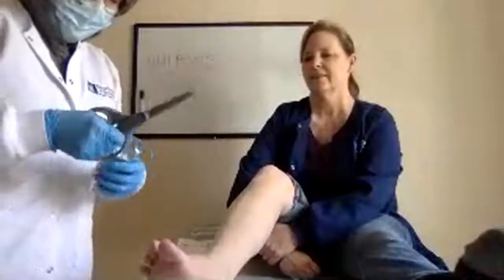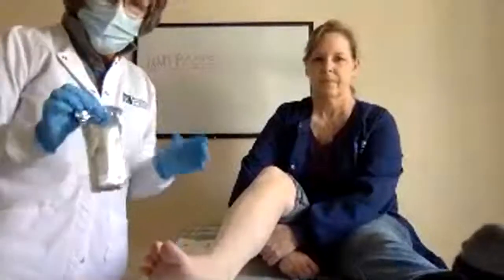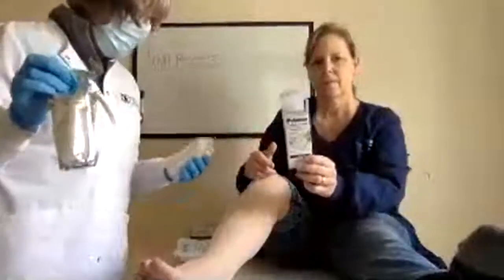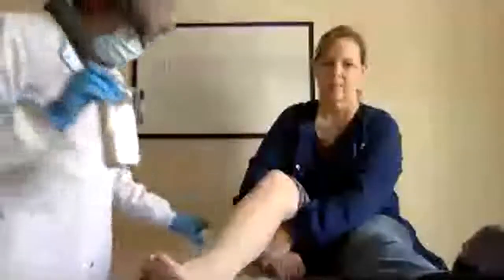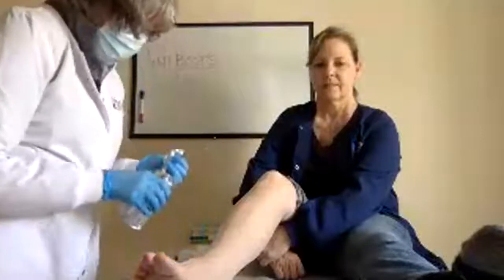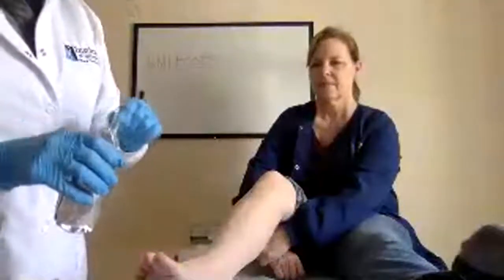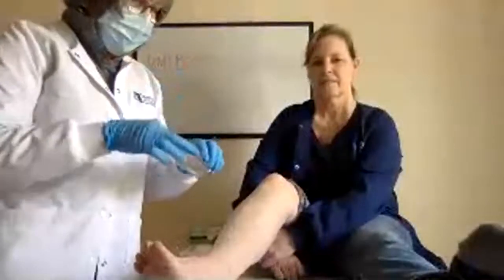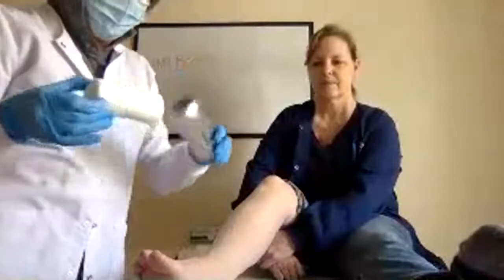So the supplies you'll need are the Unna Boots, which is the zinc oxide infused gauze, and a Curlex, and then you want an ace wrap. Go ahead and get your package open. This is zinc oxide. Like, I don't know if you ever saw people put very white, thick paste on their noses when they suntanned, or zinc oxide, what you put on babies' bottoms when they have a diaper rash.